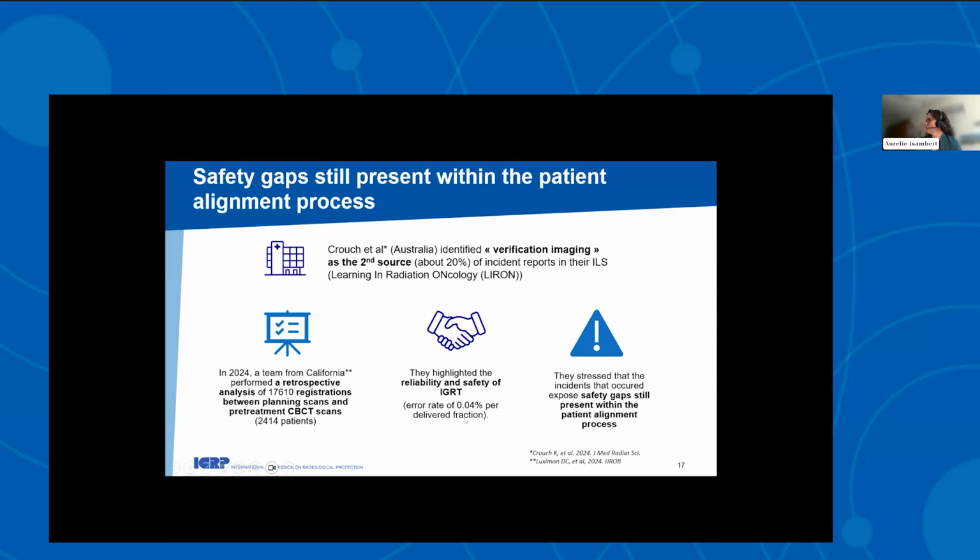But through the errors they detected, they stressed that the incidents that occurred expose safety gaps still present within the patient alignment process.